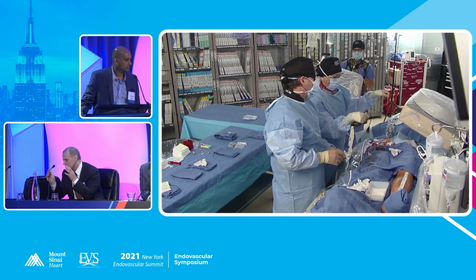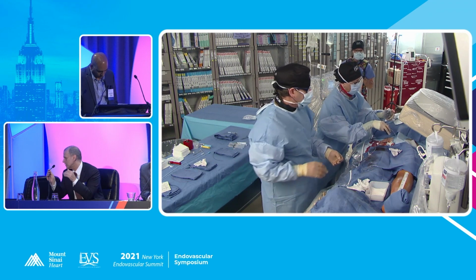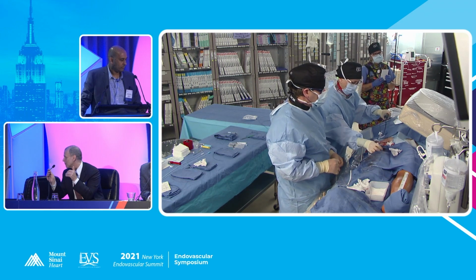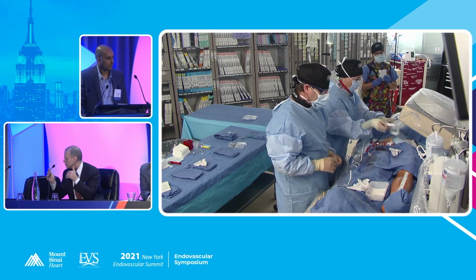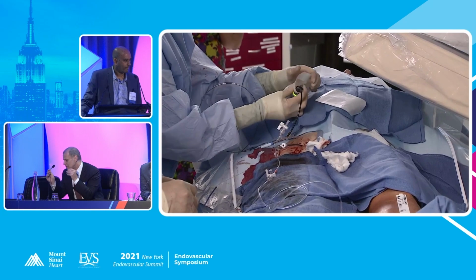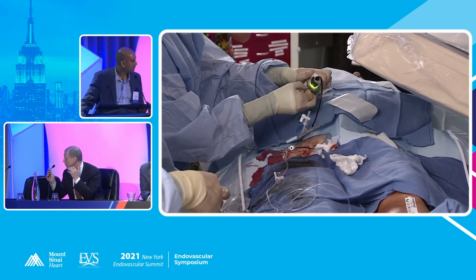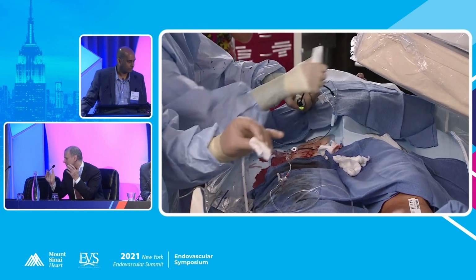I'm going to just propose the flip side of that. What's the downside of doing the femoral and waiting for the tibial? Because you have triple vessel disease. Everything you said you wouldn't operate on this guy for. If something happens downstream and you run into trouble, now you have a guy with triple vessel disease and a cold foot. Is that something you want versus just waiting to see if the common femoral solves the problem? Traditionally, a direct line to the foot is the best option. But often you have peroneals, and two-thirds of the time, having straight line flow to the peroneal will heal your wound. So what's the downside of the opposite?